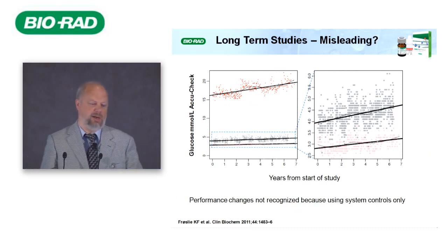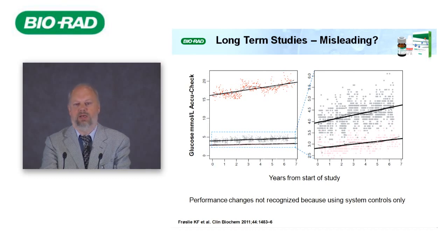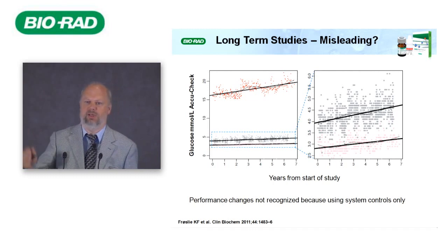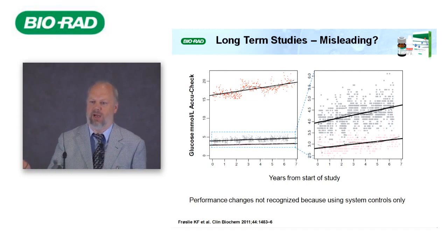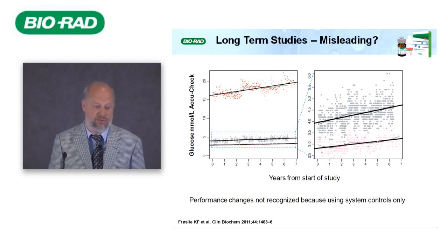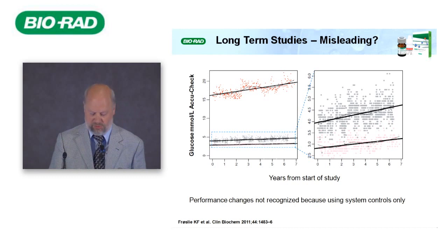Long-term studies: here is a study running over seven years on glucose that detected a shift over the years. It appeared that values in the study group were getting higher and higher. But the reason was that the manufacturer had modified the calibration over time. The wrong clinical conclusion would be that glucose is worsening in the population — but it was simply a calibration problem with the instrument.